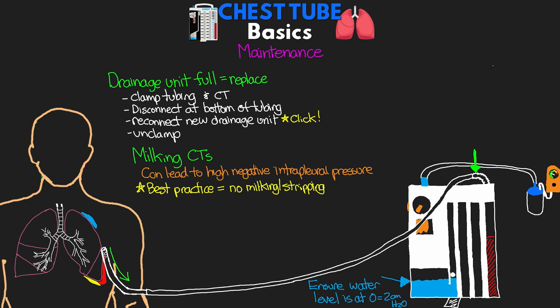Unfortunately though, I've seen this firsthand in a lot of different facilities. There are particular providers who still want this to be done. So that said, if you are doing it, you really want to make sure that you're avoiding that aggressive, strong, repetitive stripping. When you do, make sure that you're clamping the chest tube tightly with your fingers closest to the patient and then carefully pull down to move the fluid and clots along the area that you're doing this.